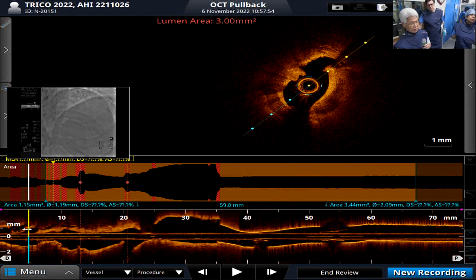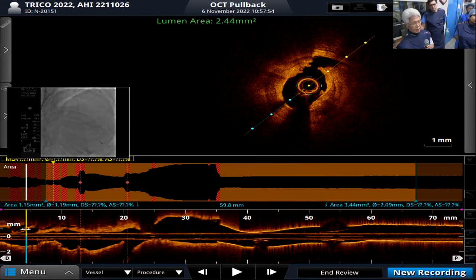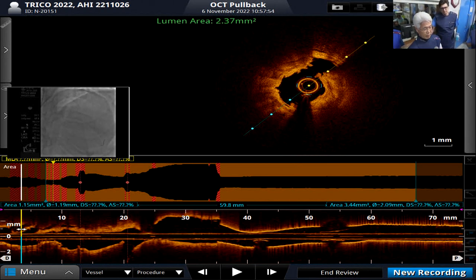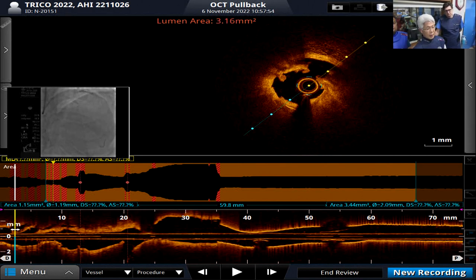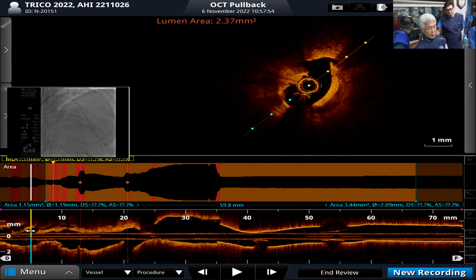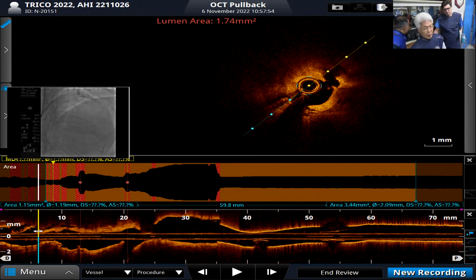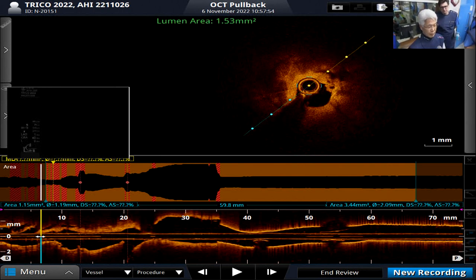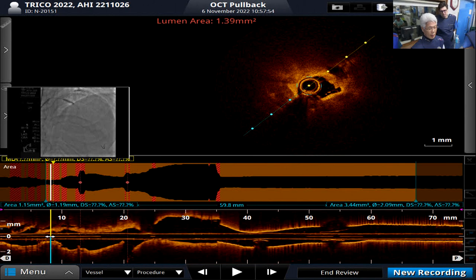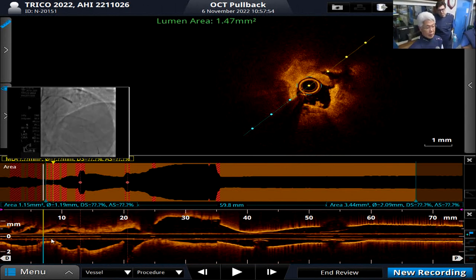Yeah, but the stent looks a little bit constrained there, so I think you need to pause that. Although with deeper calcium, this is where we have a calcium toolbox. It's not about one device or another device. It's just about what the patient needs. So if you're going to use an atherectomy technology, orbital atherectomy can address this. Shockwave lithotripsy can address this if it's necessary. But you have a very short segment of calcium. 12, 14, and in one place 16, but 16 only makes up an arc of 180 on one side and about a quarter on the other side. So a balloon expanded that nicely. You don't need it.